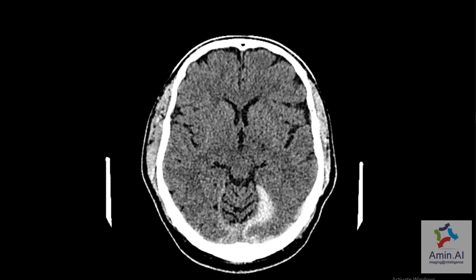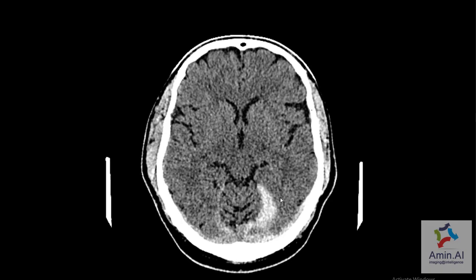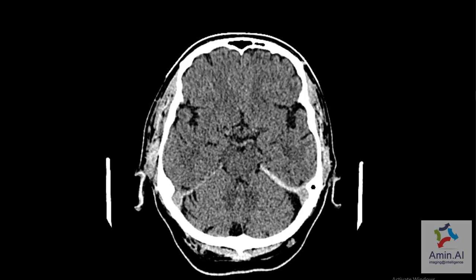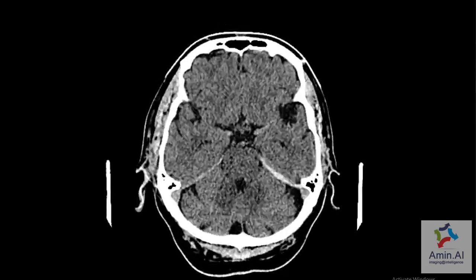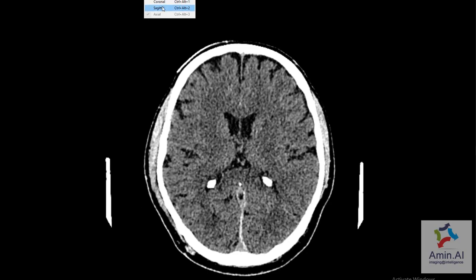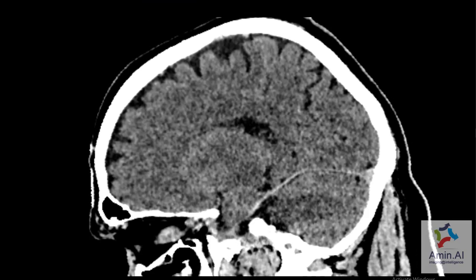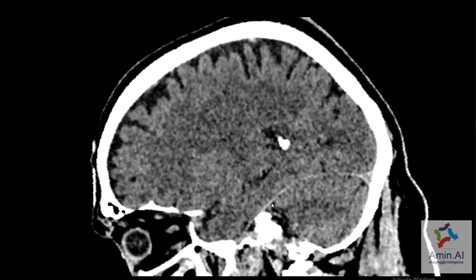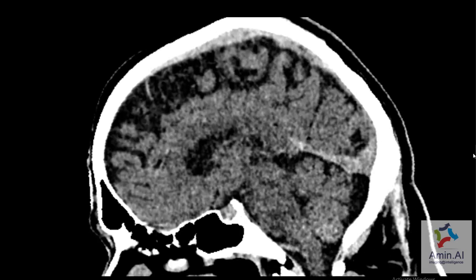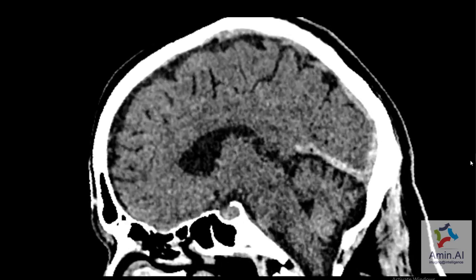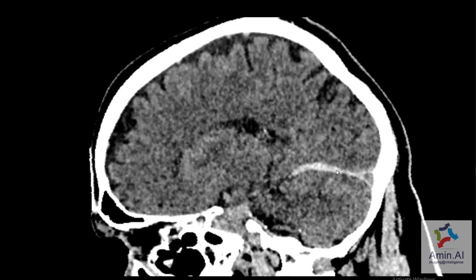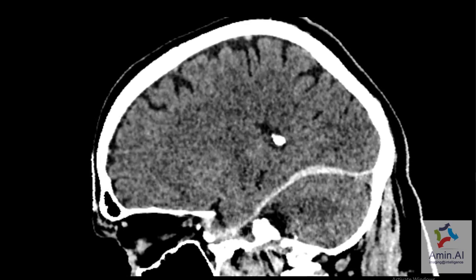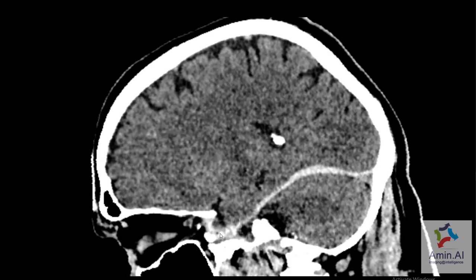If I just browse it again, one thing you are going to notice is that there is slight hyperdensity along this region, which is relatively less on this side, and the patient has a history of trauma. If I now make it a sagittal view, you will see that this leaf of Tentorium is normal on the right side, but as I move to the other side there is a thickening with hyperdensity in this region, which is extending anteriorly up to the temporal region.